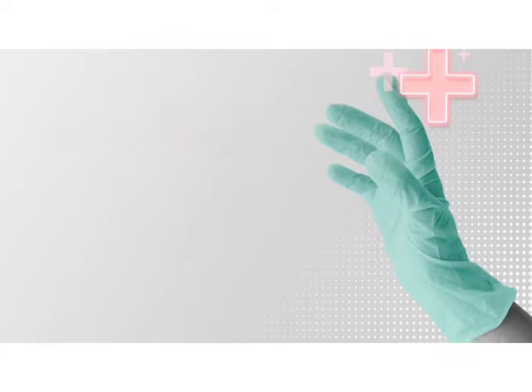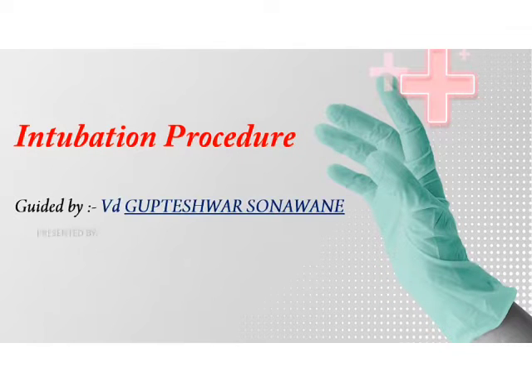Hello everyone. Today we are going to discuss the topic intubation. Intubation is a life-saving procedure performed in emergency cases in which the patient is unable to breathe or their airway is blocked.